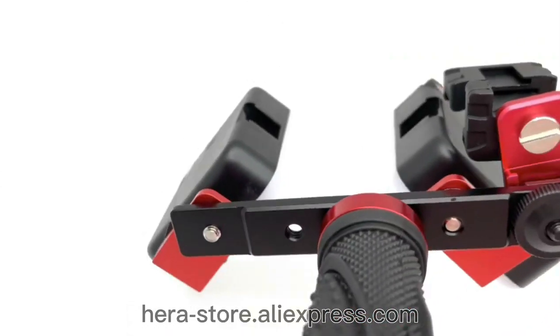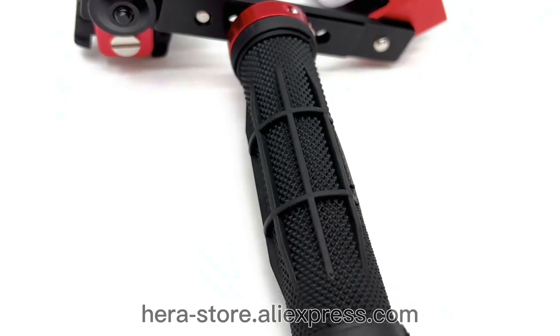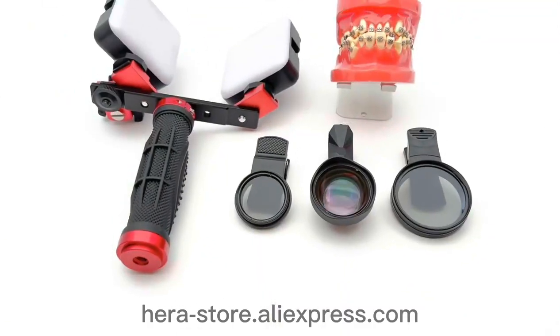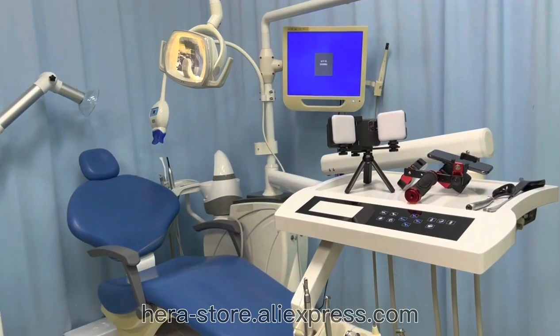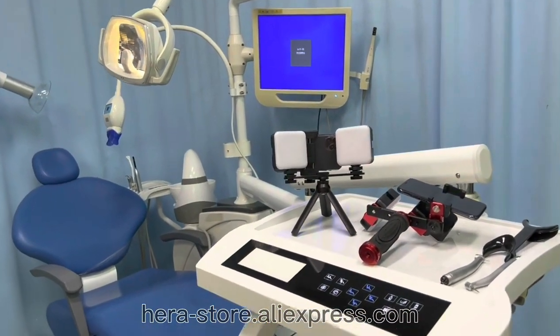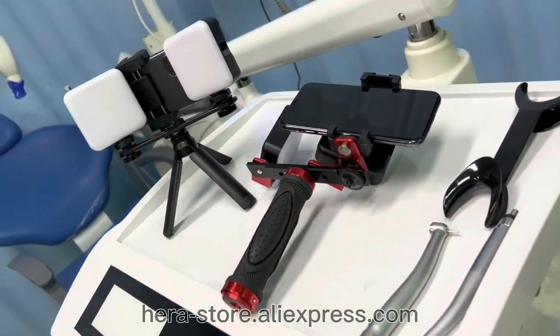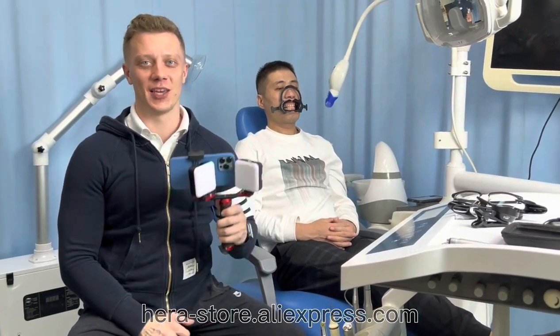Welcome. Hi, my name is Nick. I want to introduce you to our dental photographic pin light. This is the MK16.